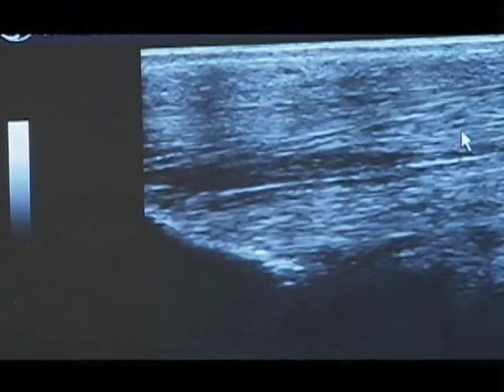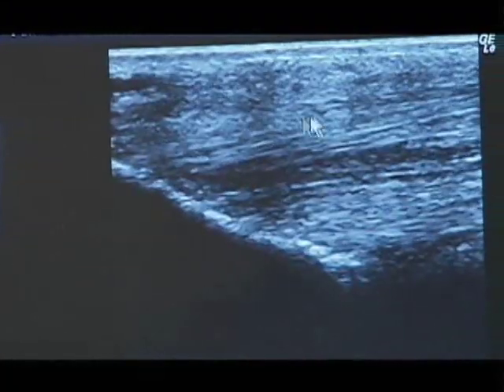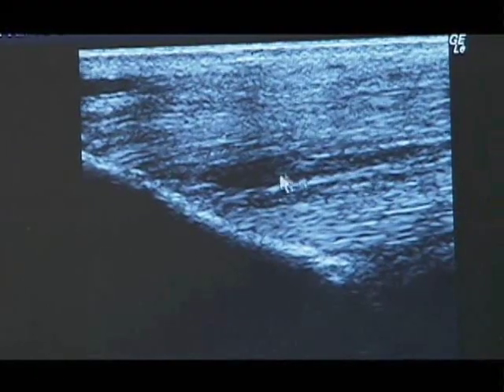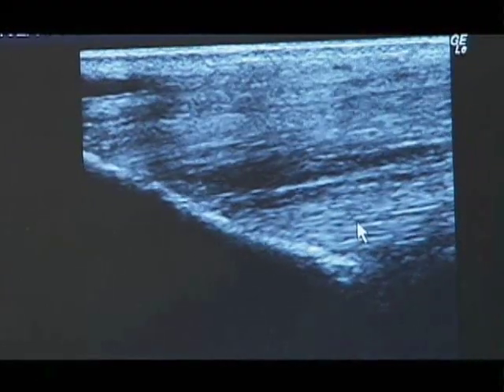We can look at that longitudinally as well, where we're looking for parallel fibers. These fibers up here look pretty normal, and these fibers right in here — this is where they're torn. That dark area right there where it's black. And then these fibers still look pretty good right there.